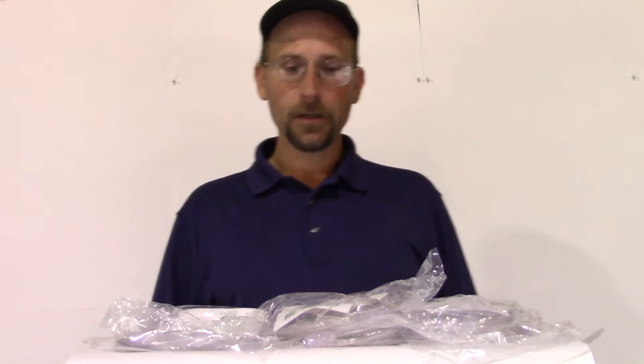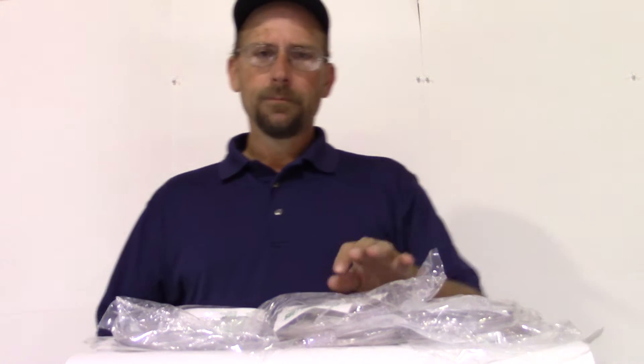Hi again everyone, it's Frank here with OxygenGuy.com. I'm here today to talk to you about nasal cannula. Unless you have used oxygen before, you're probably not really familiar with nasal cannula. But it's basically the way in which we get oxygen into us, other than a mask.